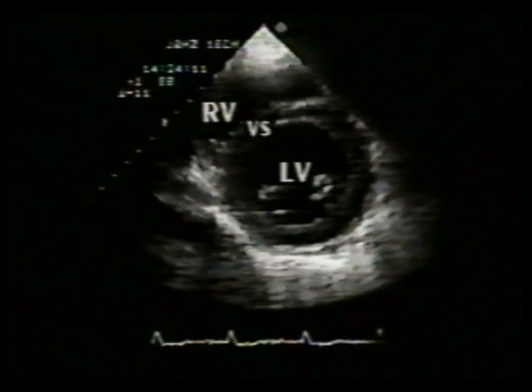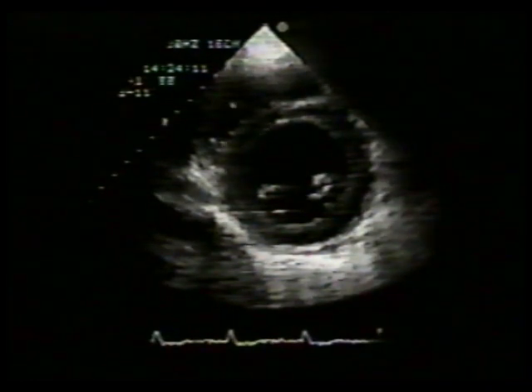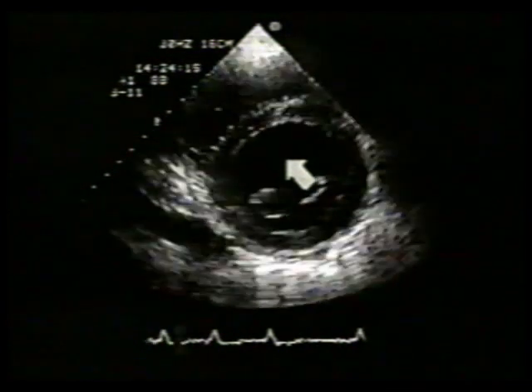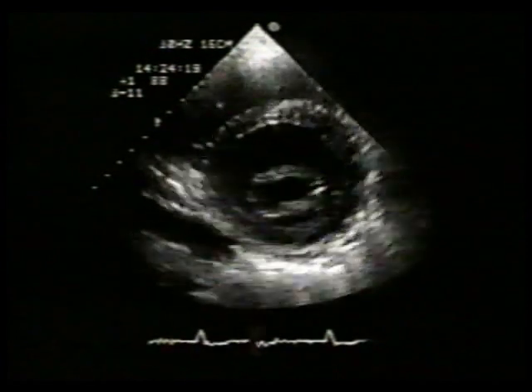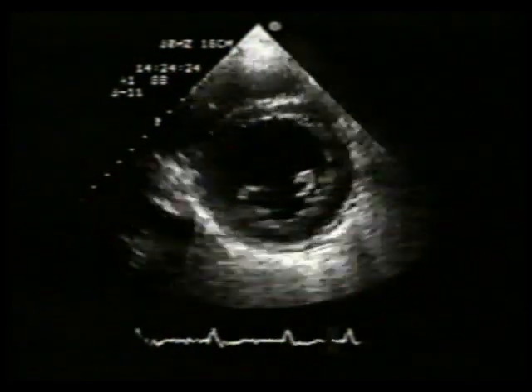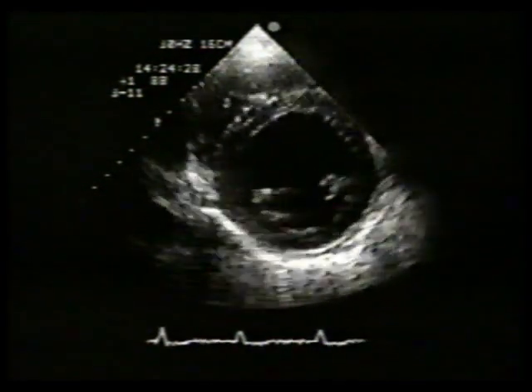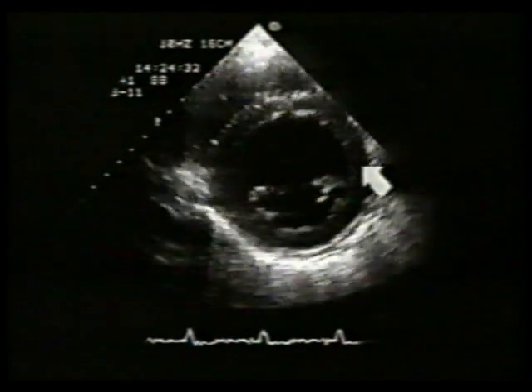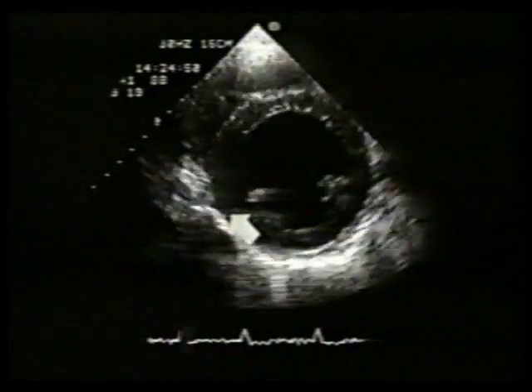This is a parasternal short axis view from the same patient at the level of the papillary muscles. The reduction in global systolic function is apparent. Note that the regional wall function may not always be uniformly reduced in patients with dilated cardiomyopathy. Frequently, the contractility of the basal and mid infralateral wall segments is better preserved than the contraction of the remaining segments.